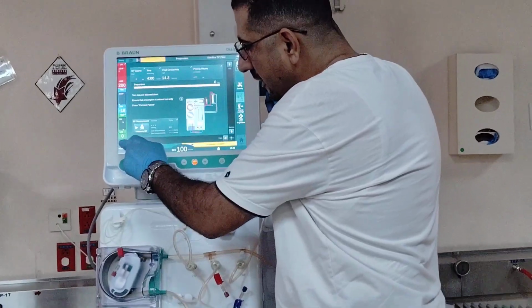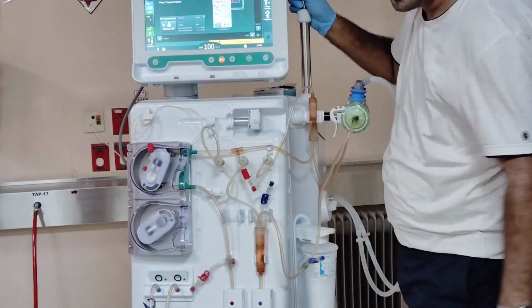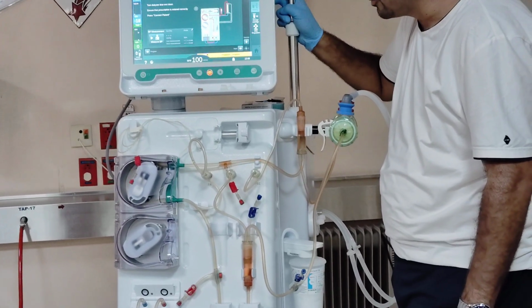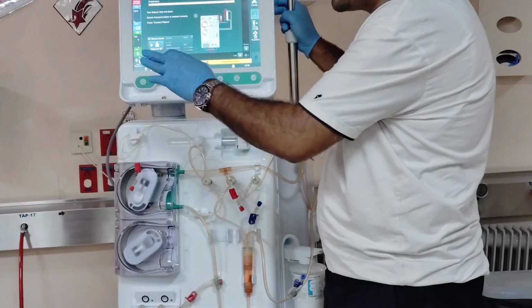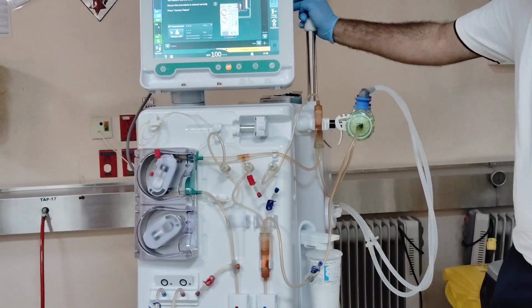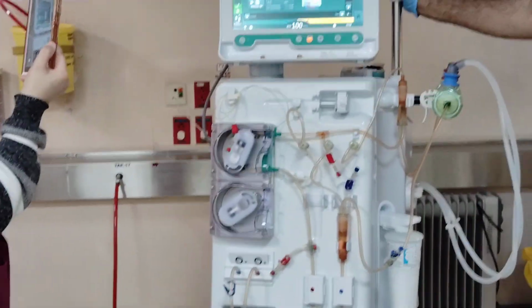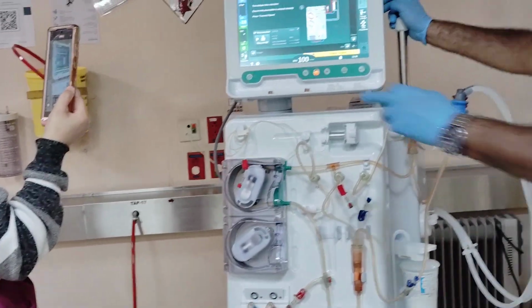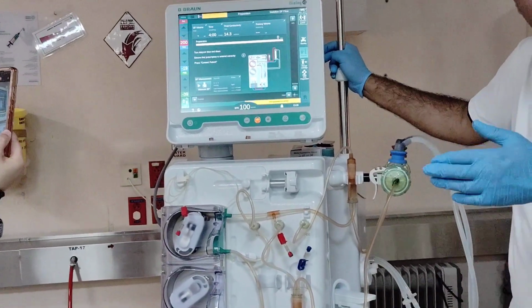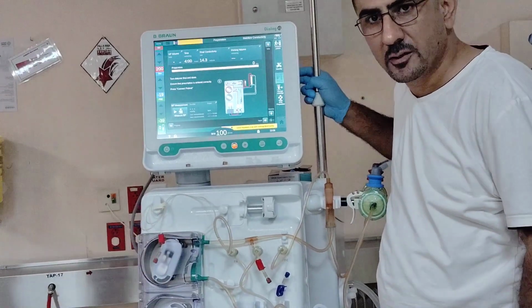Now, this is for the level regulation, to check or set the levels for the venous and the arterial chamber. You can increase the pace, but we recommend you please don't touch this one during the preparation. Why? Because the level adjustment will be done automatically by the system. If you touch it during the self-test, you will deactivate the automatic level regulation.